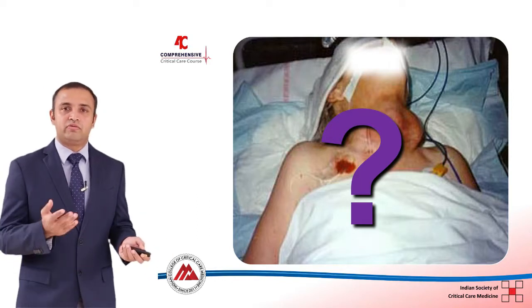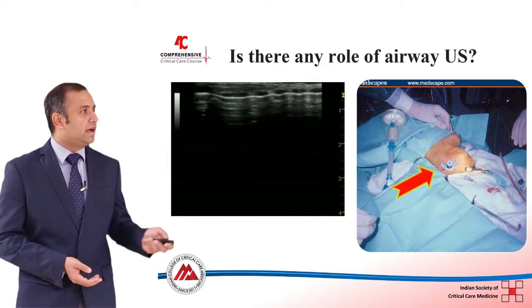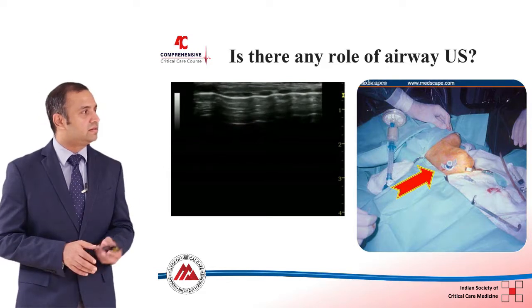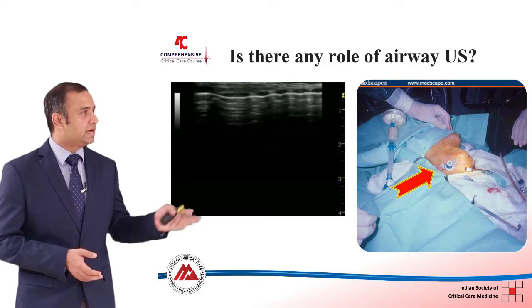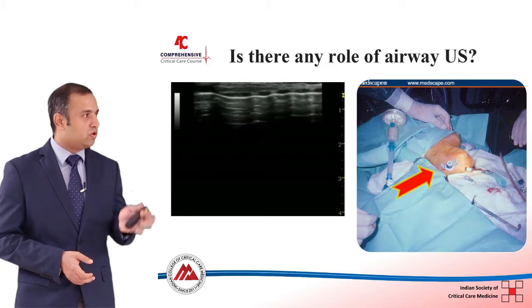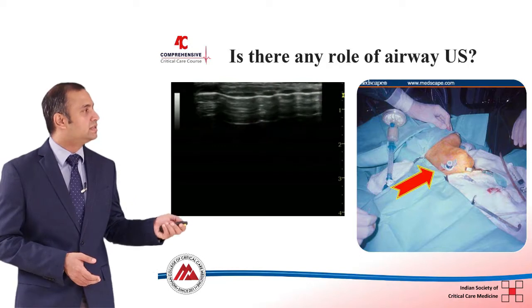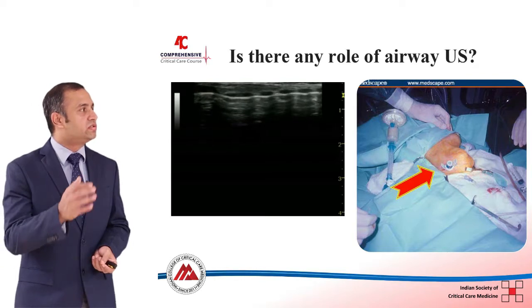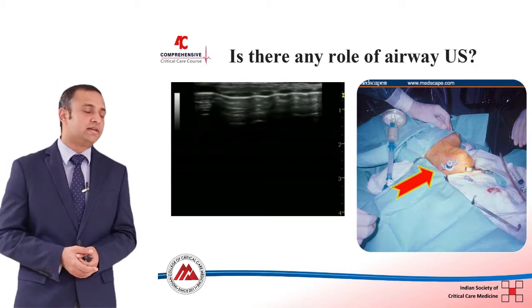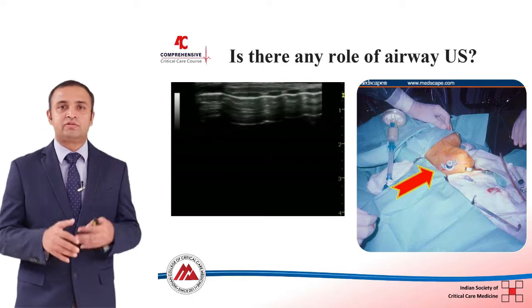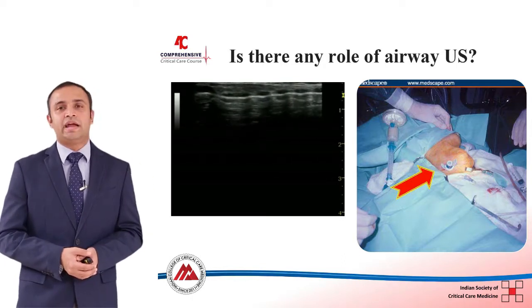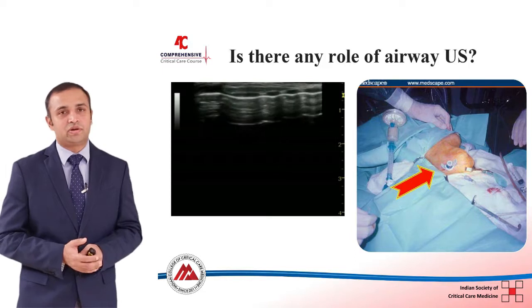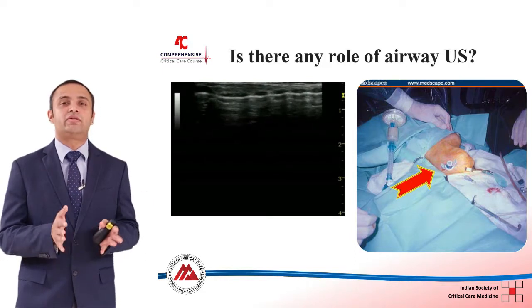So, how do I go about it unless I know where the airway is? This is where the ultrasound comes into play. As we can see in this patient, the airway has been grossly displaced much to the right. If we place the ultrasound probe along the trachea, we are going to see a series of small black rings — these are the individual tracheal rings — and the bright white line beneath them is the air-tissue interface, which produces bright white artifacts as mentioned earlier. There you can see the continuous air artifact and the tracheal rings on top, and this only occurs if the probe is right on top of the trachea.